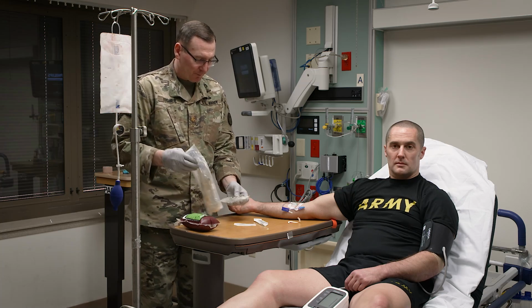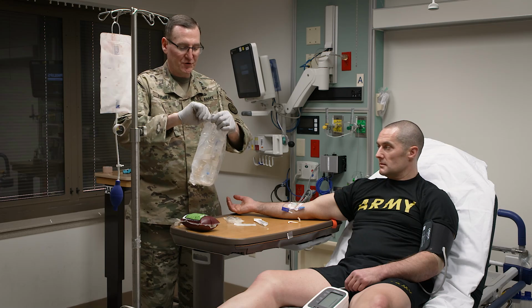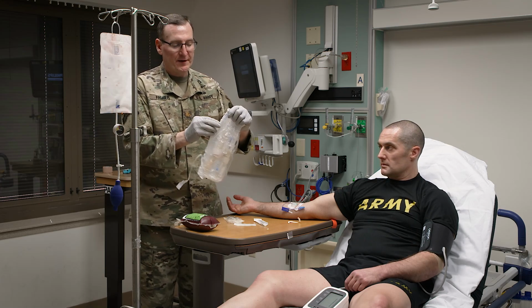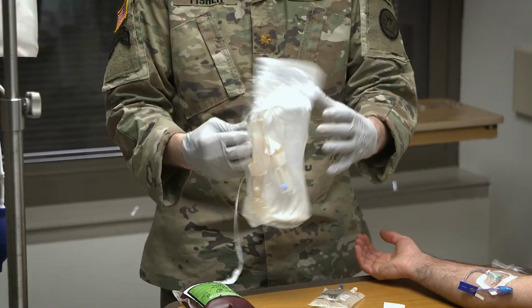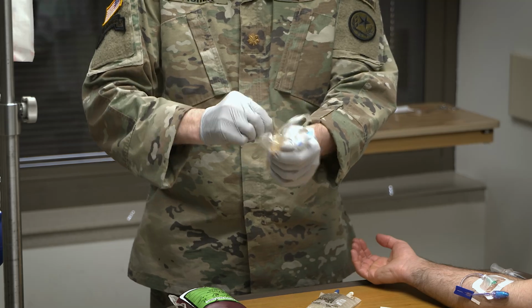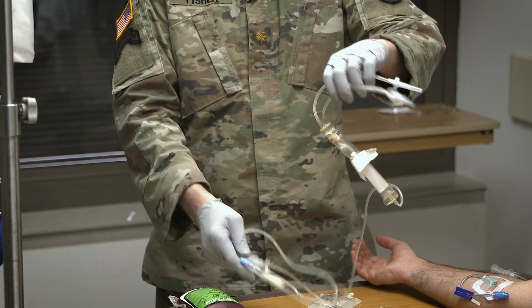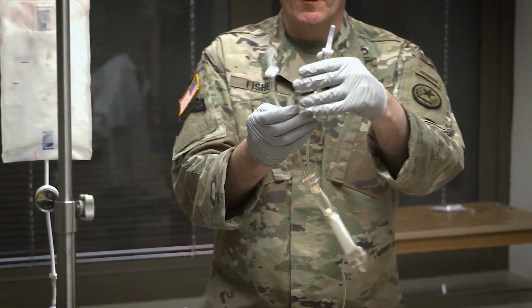So there's a couple different parts to this. One, we have our drip chamber, or administration set. Now you may find several different types out there. You can even find ones that just have a single line versus having the 2 ports at the top. This one has 2 ports at the top, so we'll talk about this.